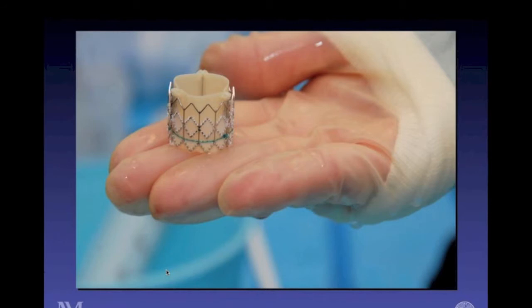So this is a nice perspective of the particular valve we're talking about. This is the Edwards Sapien valve, which is available commercially right now. And I know a lot of people don't have this perspective. Clearly, this valve is on someone's hand, so it's roughly 2 to 3 centimeters in width, and it goes on top of the valve, which is diseased inside the body.